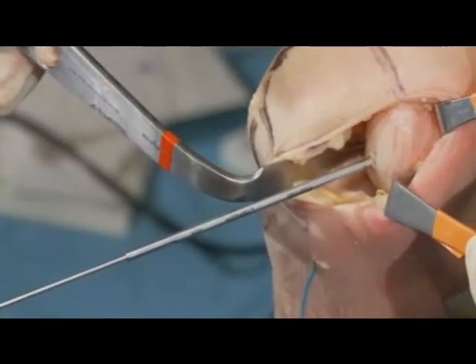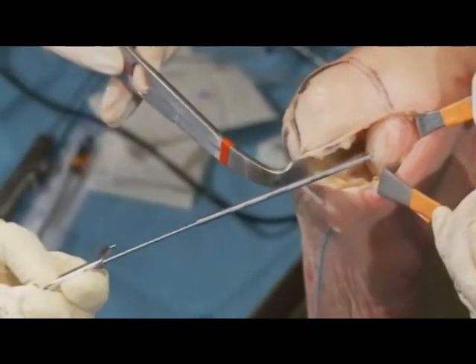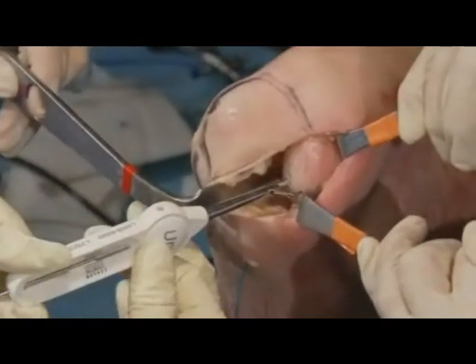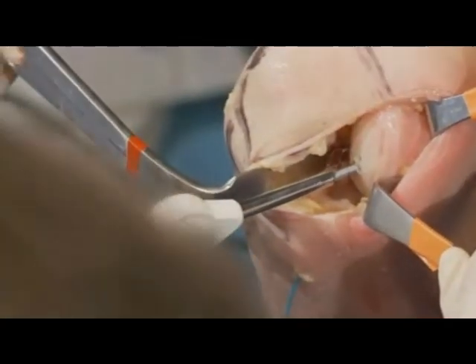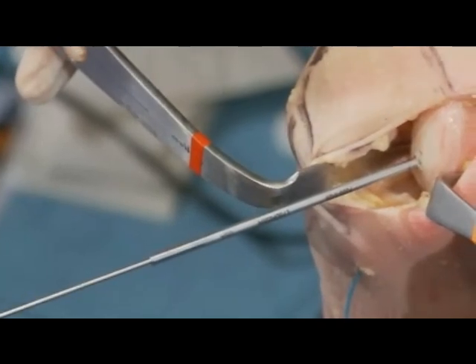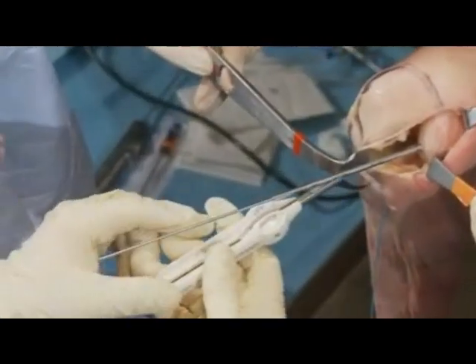So once you've got that in position, now we need to take our measurements of the curvatures that we're trying to reconstruct. This is a 20 millimeter device, so that's the width of the implant. And we're going to go medial, and that shows us it's a 3. And lateral, which shows us it's a 3. So the implant that we're going to use is a 3 millimeter implant in terms of curvature from medial to lateral.